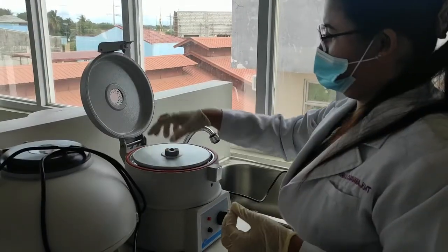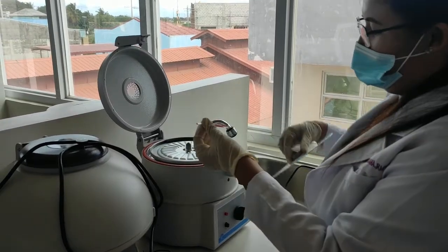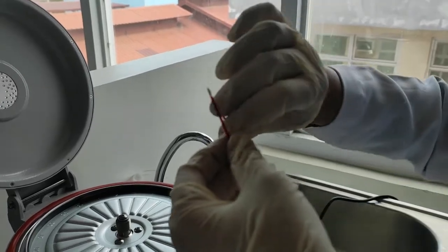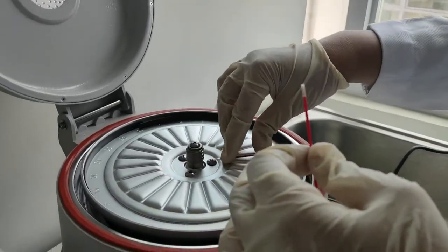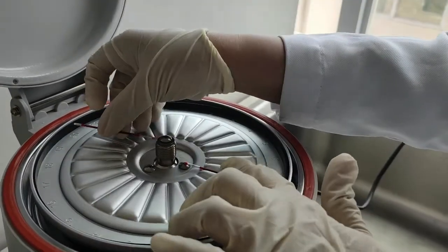Using a microhematocrit centrifuge, always remember that the sealed area should touch the rubber part of the centrifuge or else your sample will wash out. Always put the rubber part and the sealed part together or else your sample will wash out.